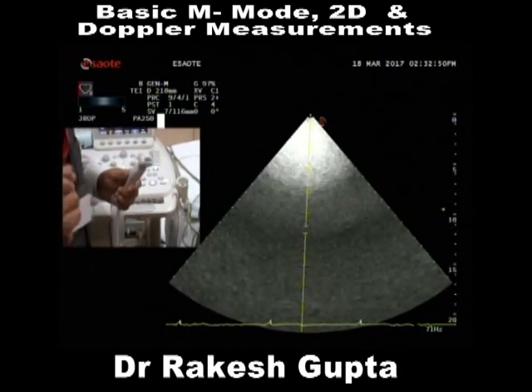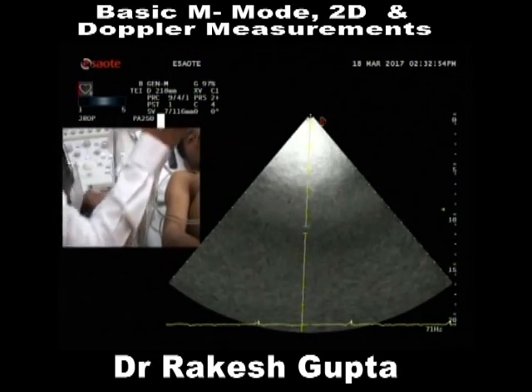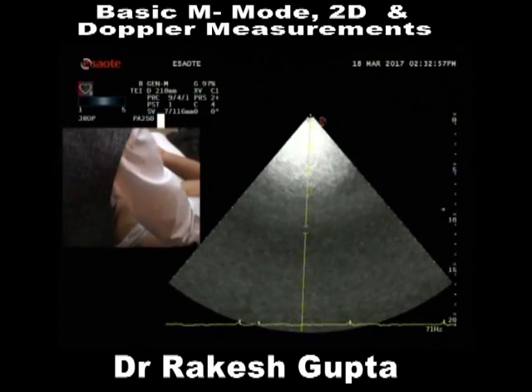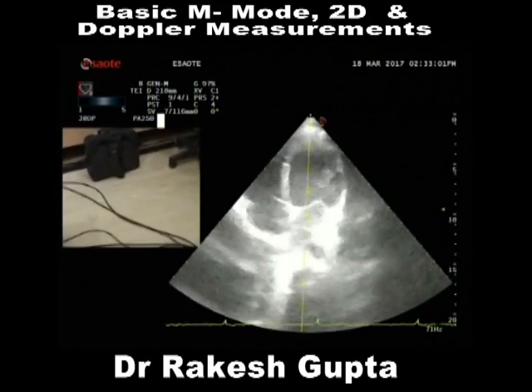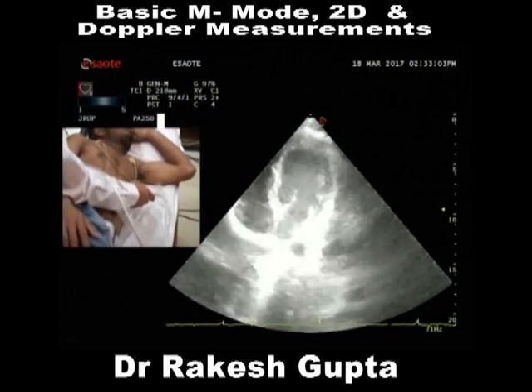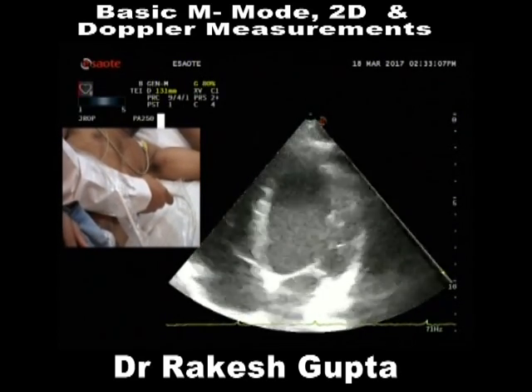Let's adopt one principle: no echo without ECG gating. So I am scanning my 4-chamber view.